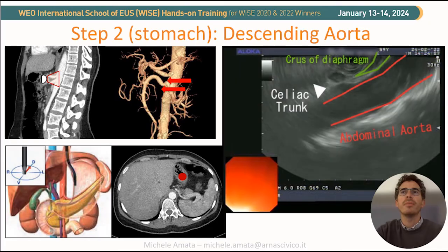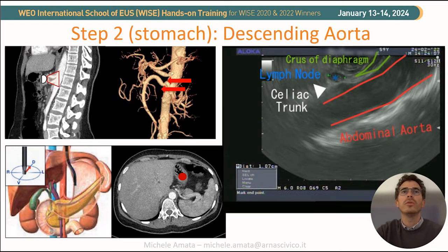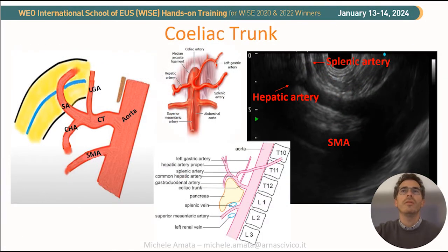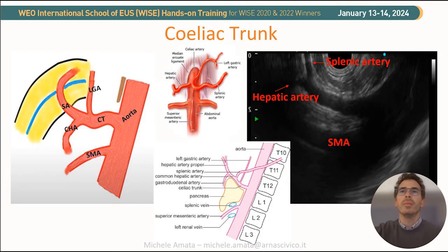This step is extremely important to define the proper location and the boundary of structures — for example, a lymph node — to distinguish if it is a thoracic mediastinal or abdominal node. Using soft movements, we then need to follow the trifurcation of the celiac trunk, which divides into the left gastric artery, splenic artery, and common hepatic artery. It is possible to visualize the superior mesenteric artery, but this is not always imaged simultaneously because they are not always in the same plane.